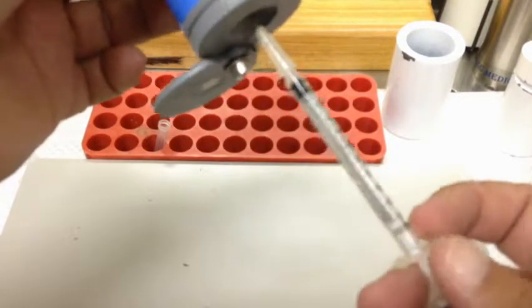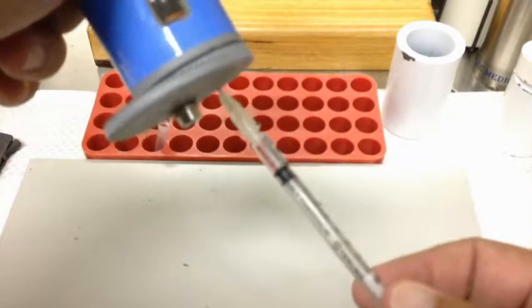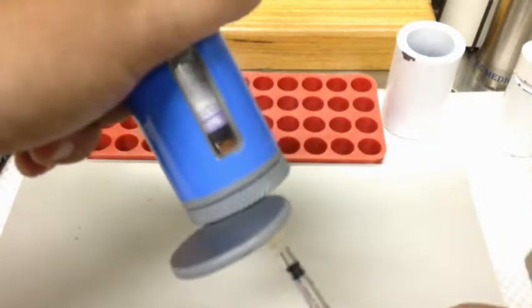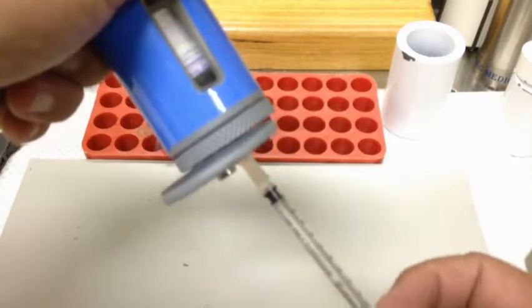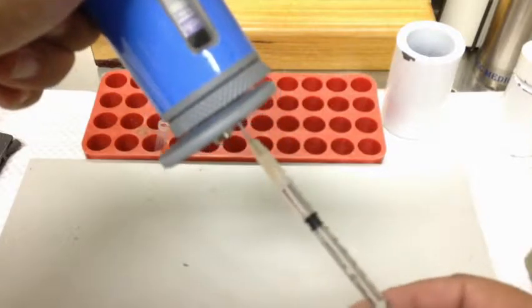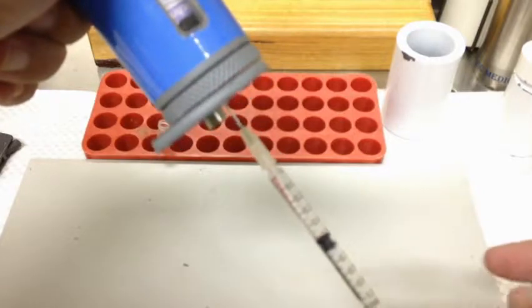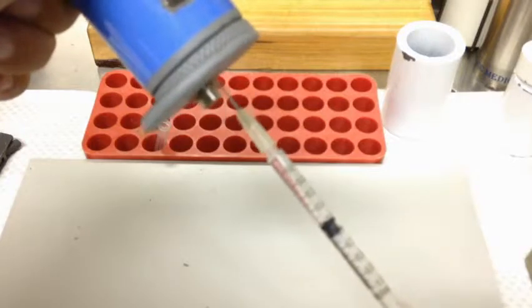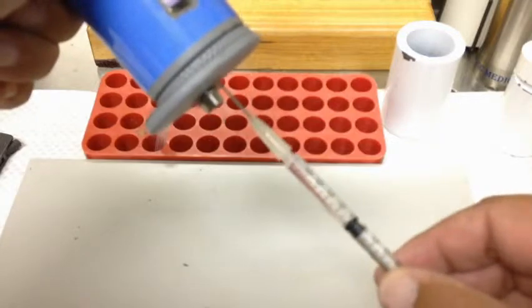We need to ensure we draw from the correct volume. If the needle is all the way in, it's just going to draw air — you're only drawing air from the headspace. If you pull the needle back, all of a sudden you get the volume of activity rather than air. In the syringe it looks fairly clear, there's no significant air bubbles — there's a tiny one at the bottom but that's okay. We've got our 0.5mL, so we withdraw that.